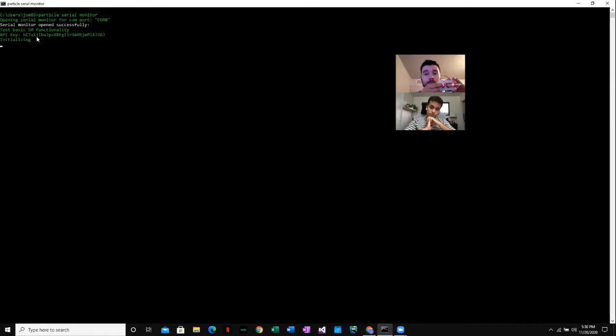And then once it turns yellow, as it did right there, it's kind of hard to see, but you'll know that it's waiting. And now we've set it at an interval of about 5 seconds to wait for measurements, just so that you can see that the Particle will ask for measurements. When the RGB LED on the device is blue, that means that it's waiting for a measurement and the measurement process hasn't started. The moment I put my finger on it, you'll see it turn purple.